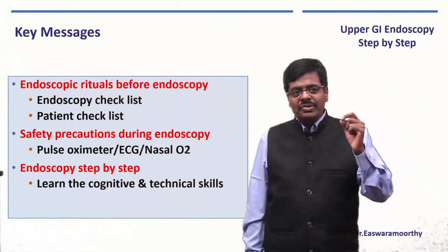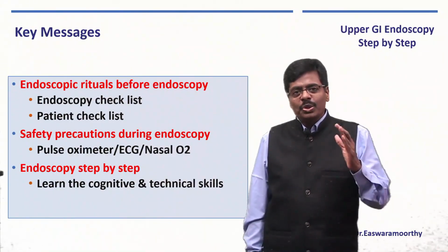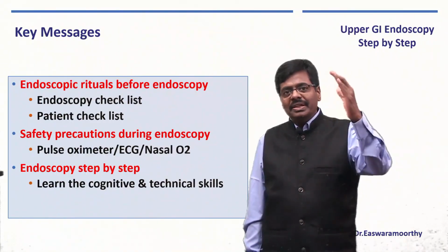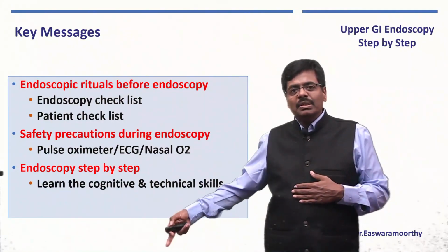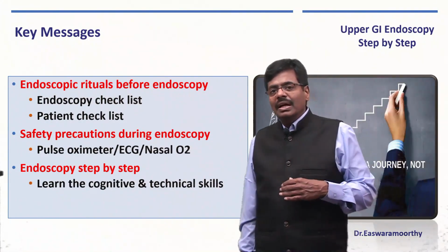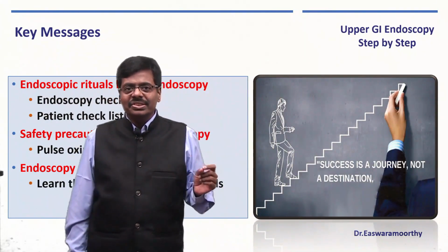And endoscopic steps, as I said, it is just today you are learning the technical skills. I am sure the cognitive skills of interpreting the results, and also for all the pathologies, everything is going to be in the subsequent classes you will learn, because here the training or a success, anything is just a journey, it is not a destination.